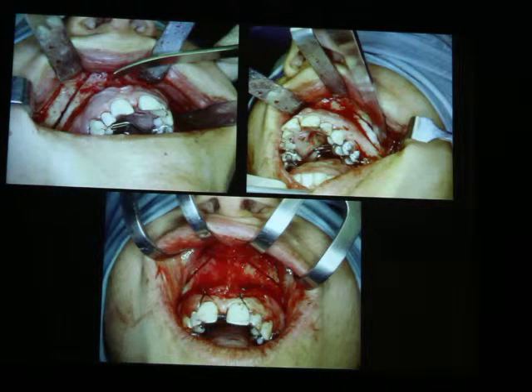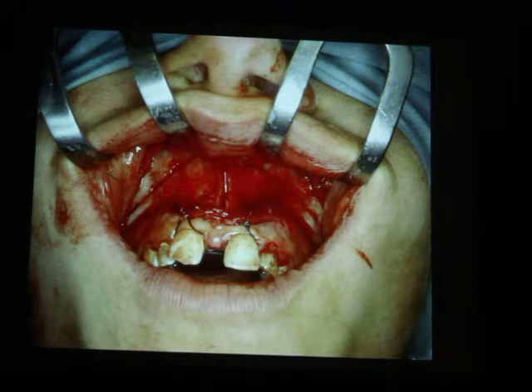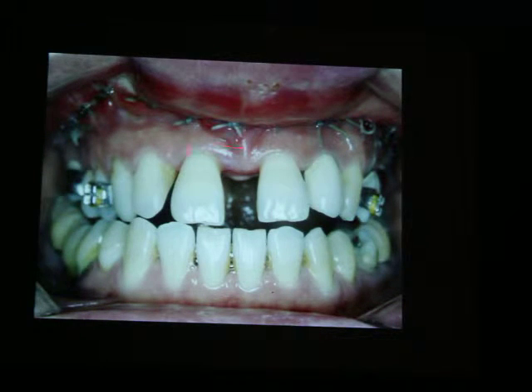The diastema should appear as well in these patients who are out of growth. Here the patient has been expanded during surgery. So let's see here. Yeah, you see the diastema even with the suture still on. You get this nice opening with the activation of the expansion screw. And here you can see the sutures and the opened joint line.